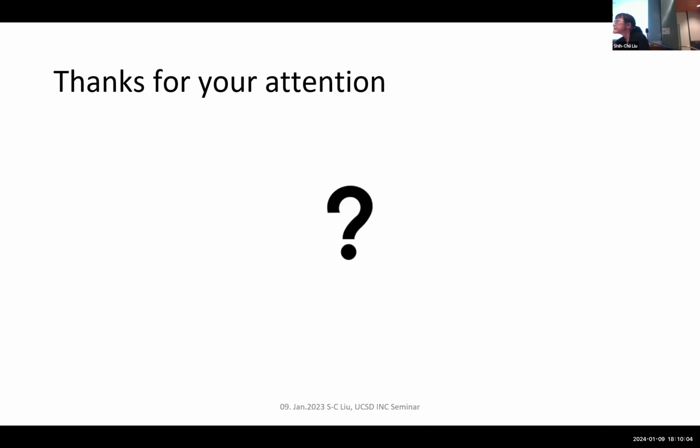Do you expect any issues with differences of how we can... Not at the moment, because we're bypassing the whole retina stuff and going straight to the cortex. I think it's more about understanding, when you stimulate at different places in the visual cortex, what picture you see in front of you, and then you have to stimulate the electrodes correctly so that you see an image, if that's what you want that person to have. In the UMH experiments, they go through each electrode and stimulate it with different levels of current so they can understand how strong the percept is and where it is located. Once they have that, they can create the proper output.